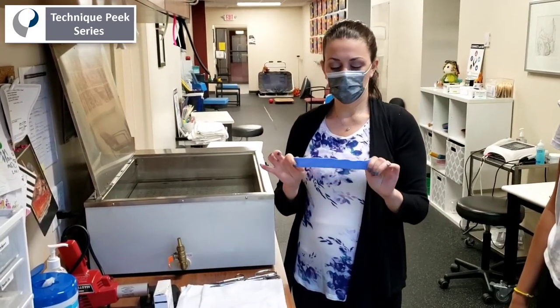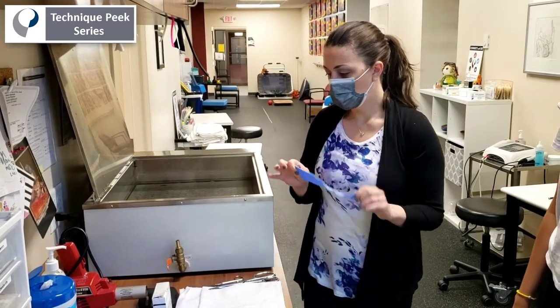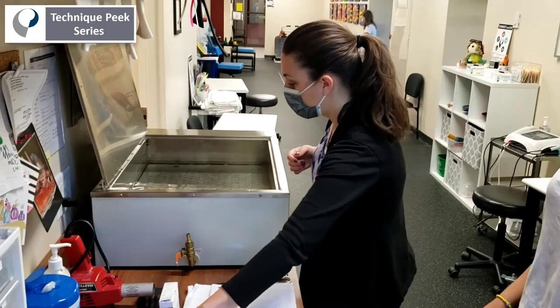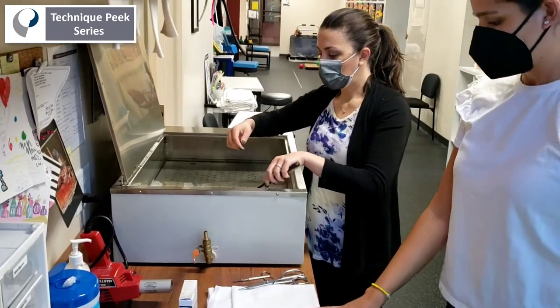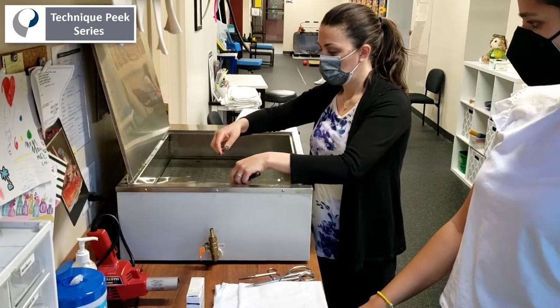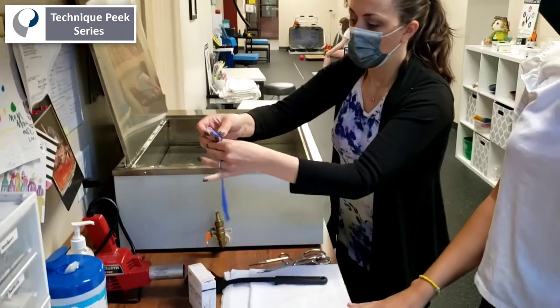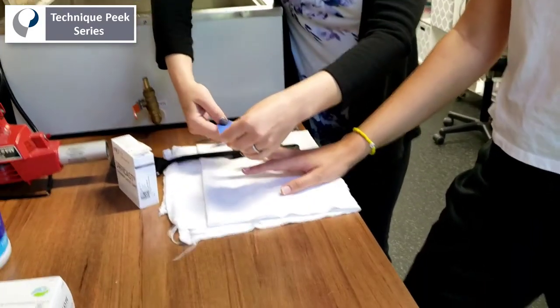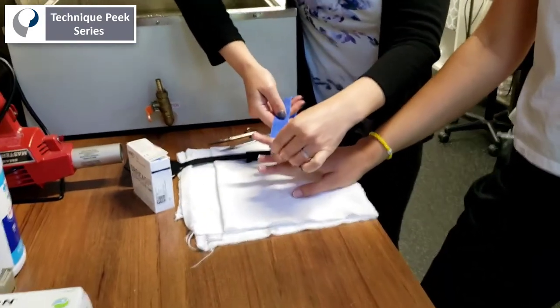Depending on the size of the finger, we're going to start with a strip of the material cold, dip it in the hot water, and when you take it out, you want to make sure you wring out the excess water because it's quite hot and you don't want to burn the patient. So take it out, wring out that extra water, and you've got to move kind of quickly.